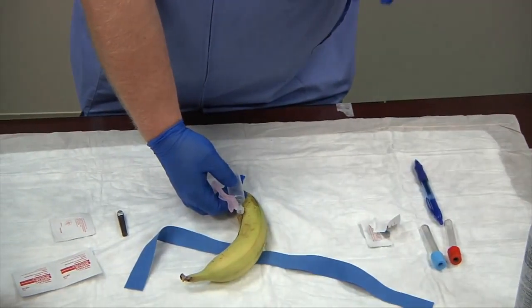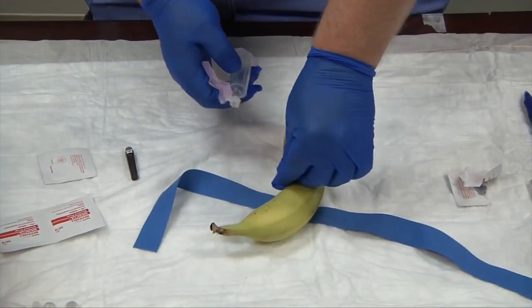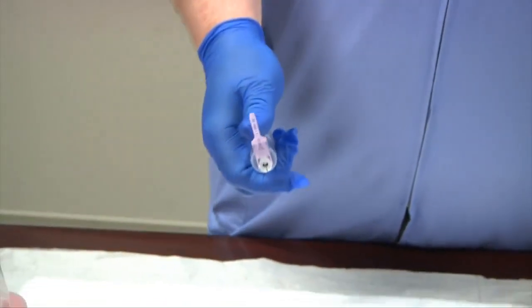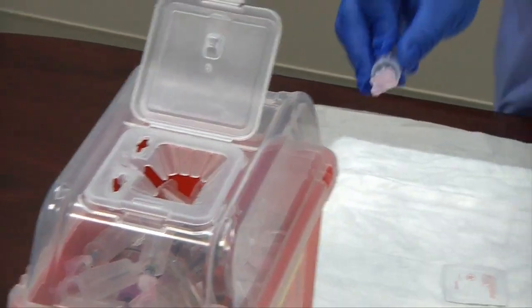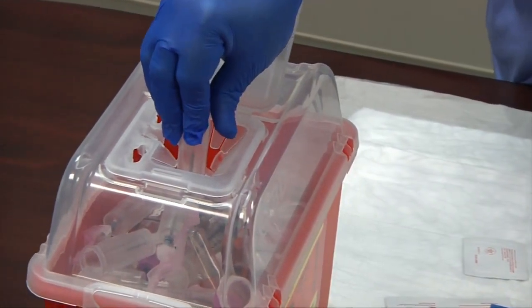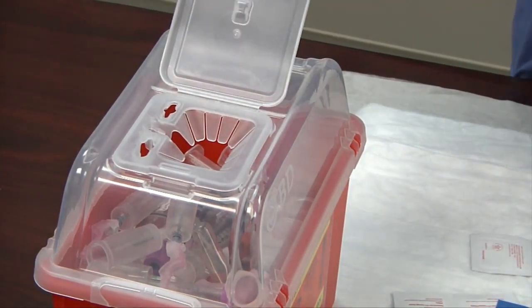Pinch your gauze and fold it over in four corners to make a pressure bandage. Pull out the needle and immediately cover with gauze and safety cap all in the same motion. As you pull your needle out, immediately safety cap it and go directly into the biohazard box — never lay it on the table. Drop the needle in freely, being careful not to stick your finger into the container. We never pull needles or any trash back out of the biohazard box.